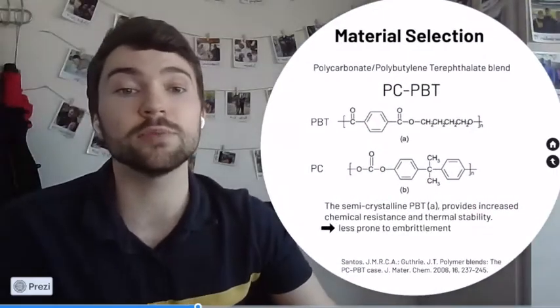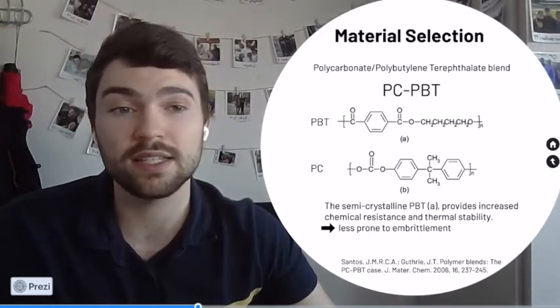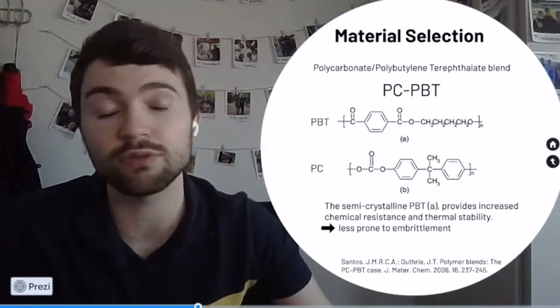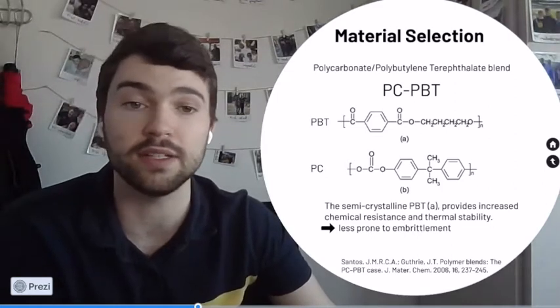So although the original material considered for the Delscope was a PC-ABS blend, a literature study revealed that the slightly more expensive but also readily available PC-PBT blend is more resistant to embrittlement when put under a constant strain while being submerged in aggressive disinfectant for a 24-hour period.